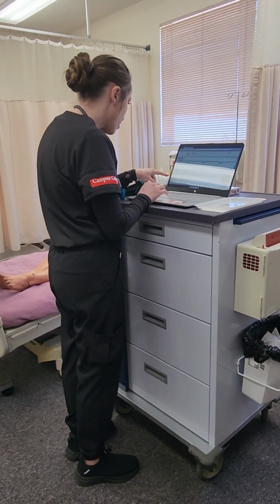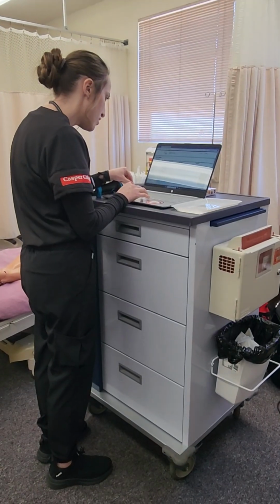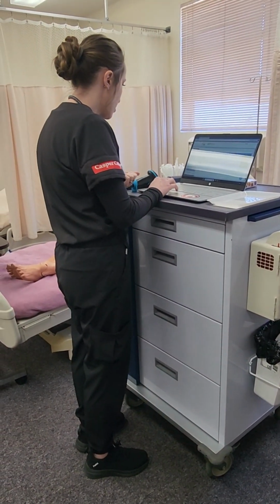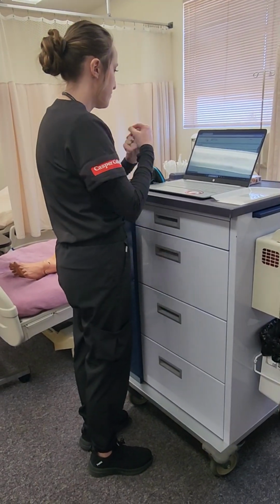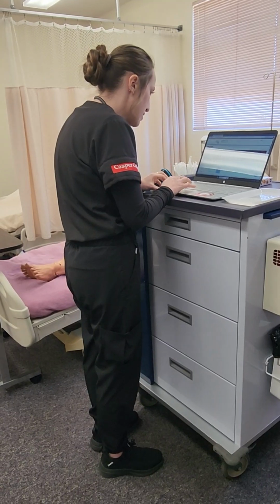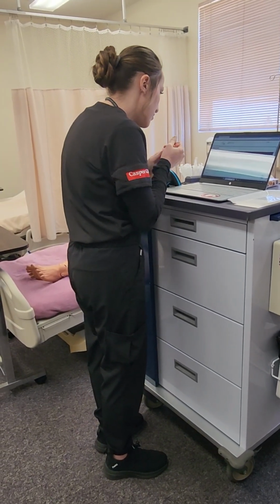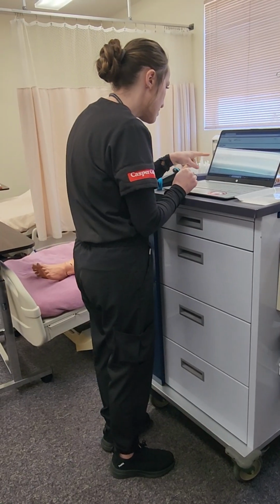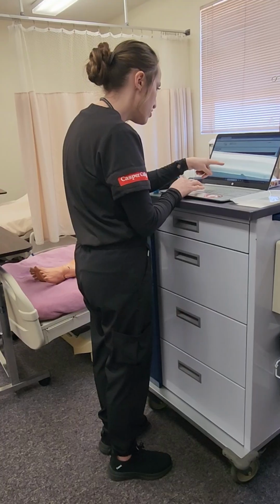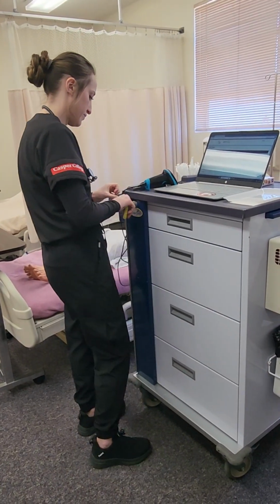It looks like she is due for her heparin sodium, 500 units every 8 hours subcutaneously. So I will go back to the MAR and make sure that's in there as well. It looks like she is due for this after the 8 hours. Again, it's heparin sodium, dispensed as 1,000 units per 1 ml. Her dose is 500 units, so she will receive 0.5 milliliters.